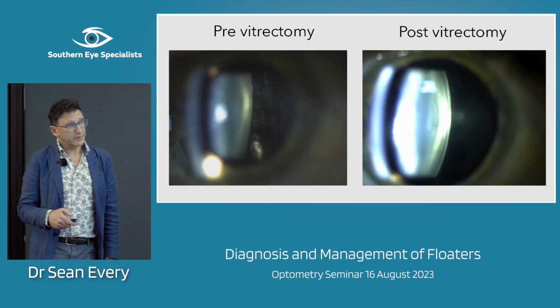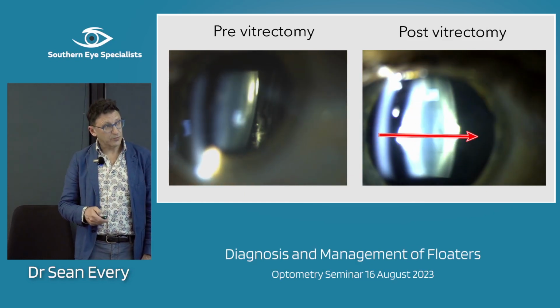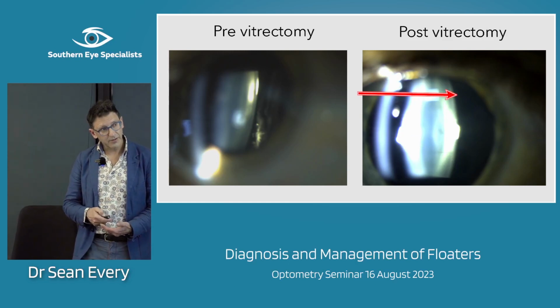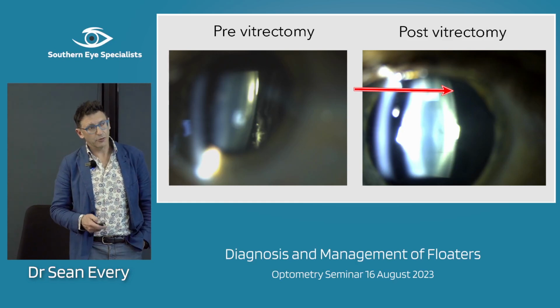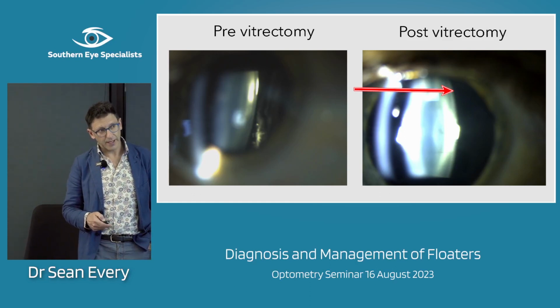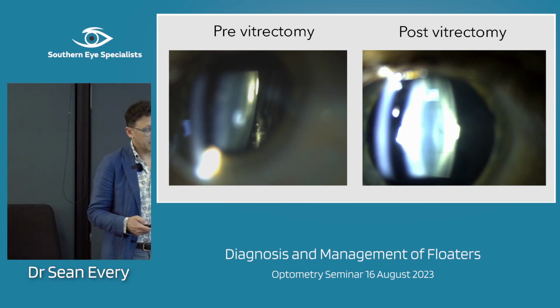So on the left, pre-vitrectomy, on the right, post-vitrectomy, same person. That is optical clarity, and that's what these people are after. It's amazing. Obviously you can't come anywhere near the posterior surface of the lens here, but it's still pretty good. There's no real fringe. If someone's pseudophakic, if they've got an IOL in here, then I can come absolutely right up behind that plane with the cutter, and probably do a surgical capsulotomy if they haven't had a YAG PC done. You just chomp through that and get rid of everything.